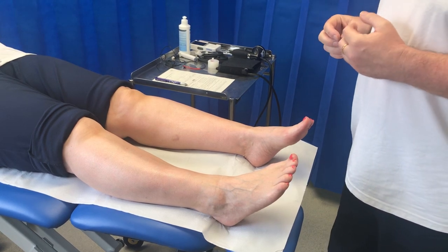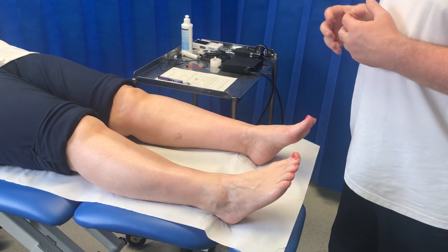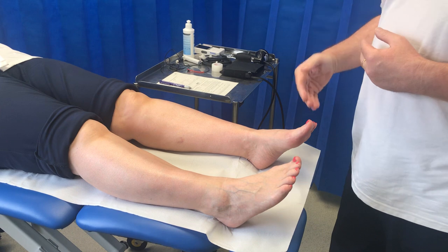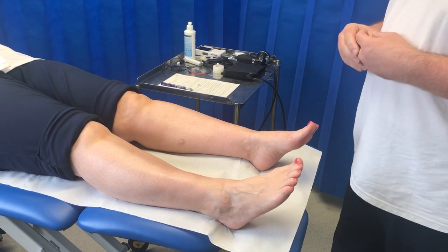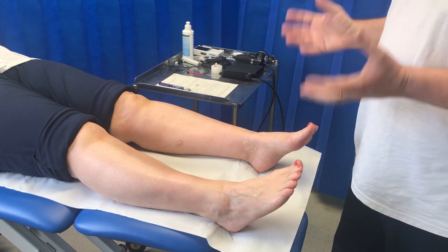I'm going to demonstrate a brief critical limb ischemia assessment, which would usually be done in the presence of a non-healing foot or leg wound, or constant pain in the foot or toes that has been there for more than two weeks, but not controlled by usual pain medicines with no other obvious cause.